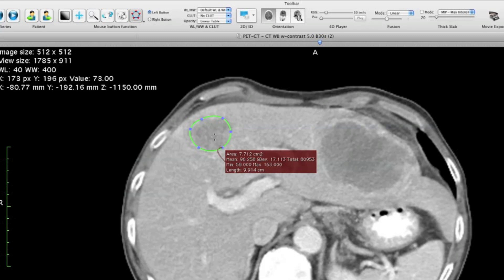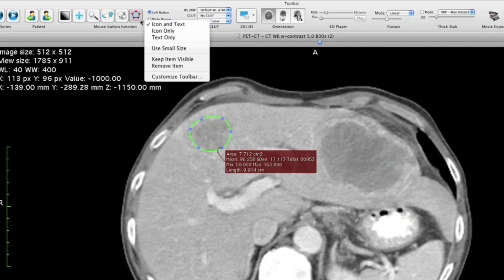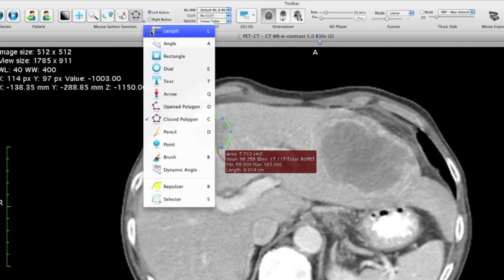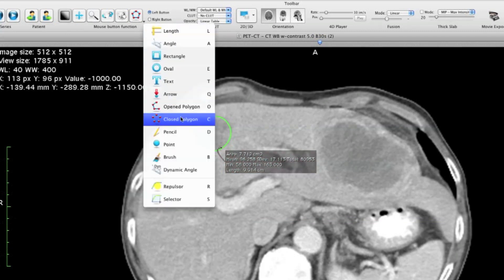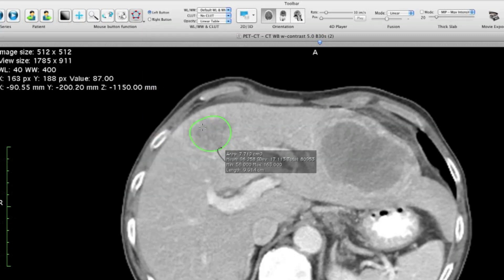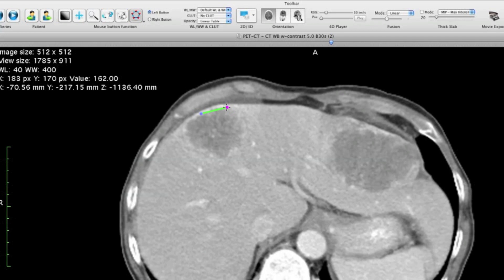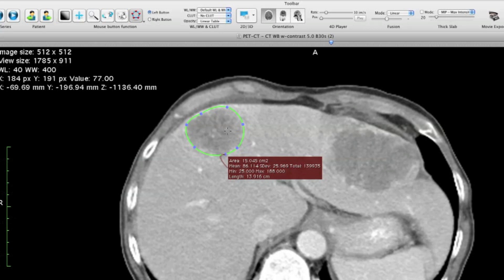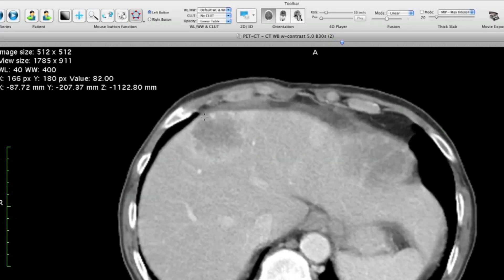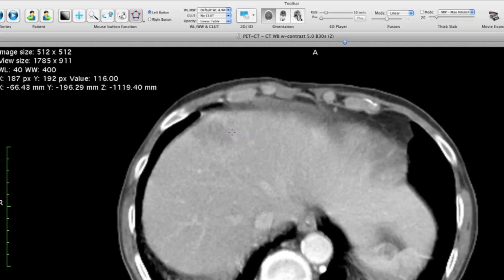To find the closed polygon tool, open up the ROI toolbar and select it — you can also press the hotkey C for the closed polygon. Now you have one polygon. Go down a few slices and draw the next closed ROI. Repeat this three or four times. Importantly, you must have ROIs on the first and the last slice where you see the lesion.